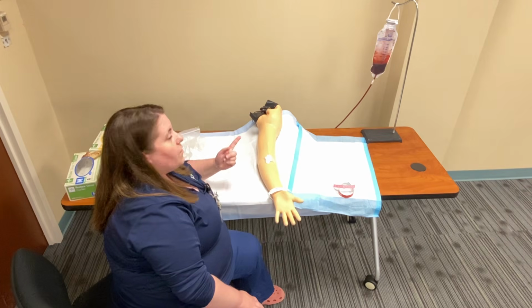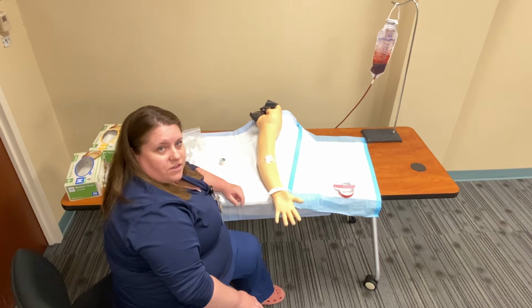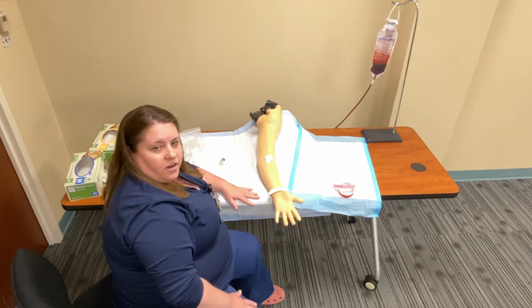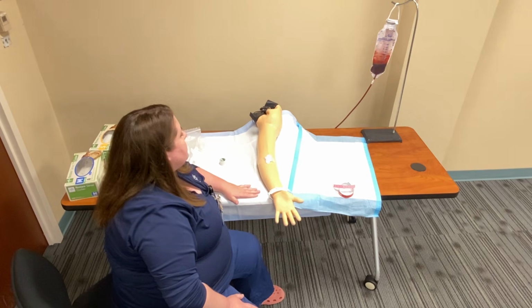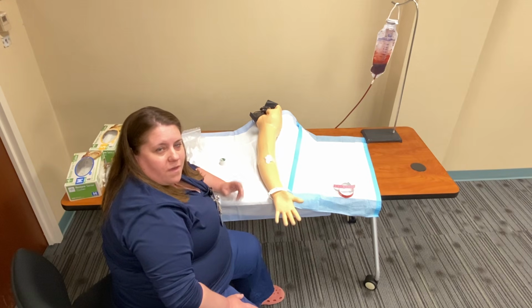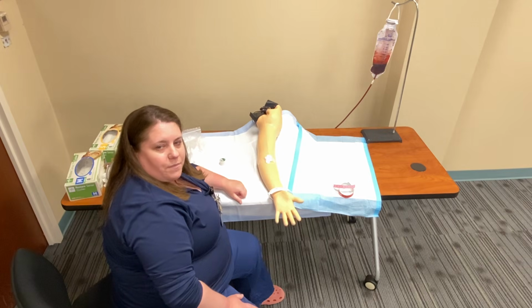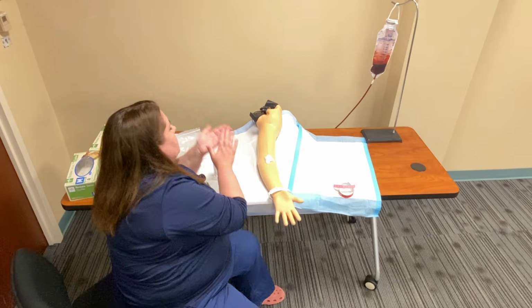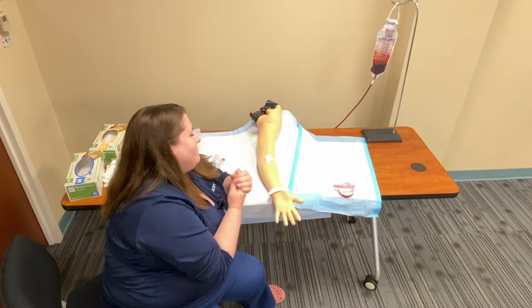I want to make sure that her pump looks okay if she has an IV. I'm also going to look at the IV site to make sure that looks okay. And make sure the room is quiet enough for her, ask her if she has any questions. So I've done my P's and Q's. Then I'm ready to leave the room. I'll let her know I'll be back in about an hour. She can call me if she needs anything, and I'm going to send my sample to the lab. Before I leave the room, I wash my hands, and we are finished with our butterfly vacutainer method. Thank you.